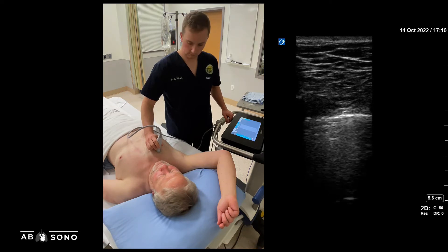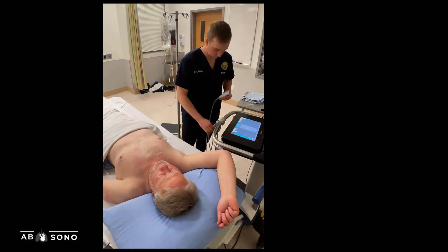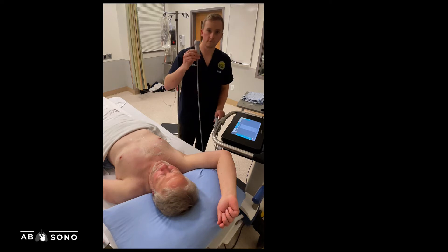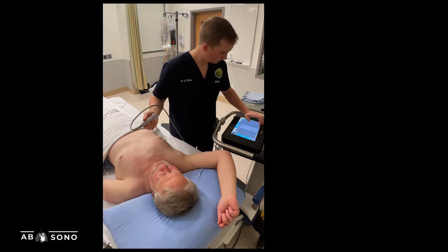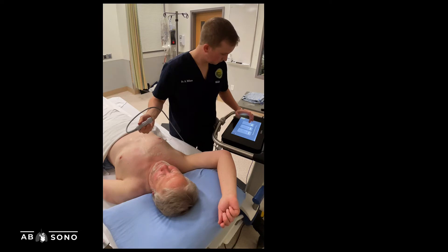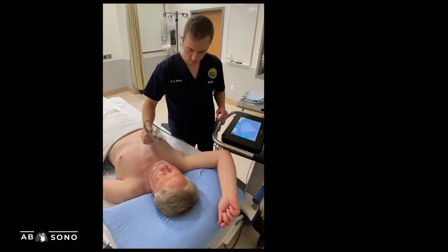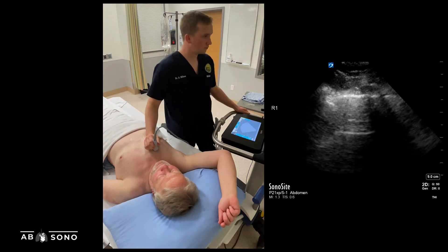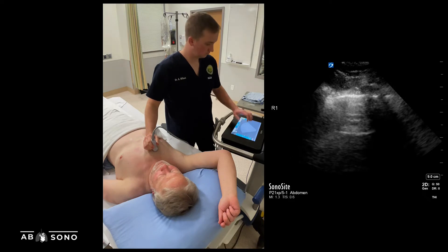For more comprehensive lung ultrasound, we favor the phased array probe. The phased array probe provides generally adequate visualization of the pleural line, but also generates higher resolution images of deeper structures. In addition, the smaller probe footprint minimizes issues with rib shadowing, especially in acquiring images from the lateral and posterior chest.